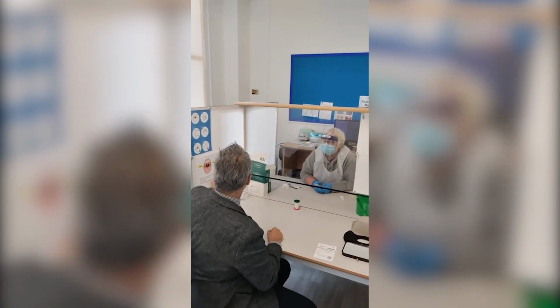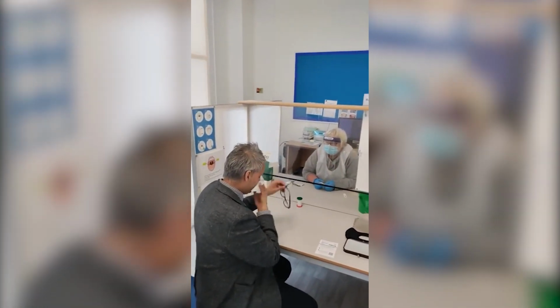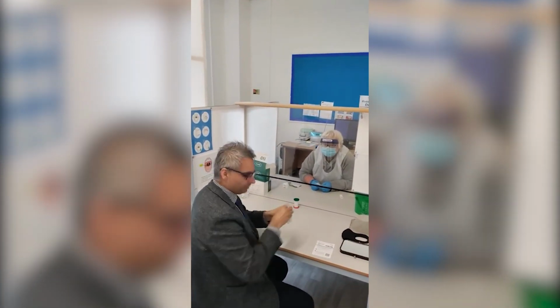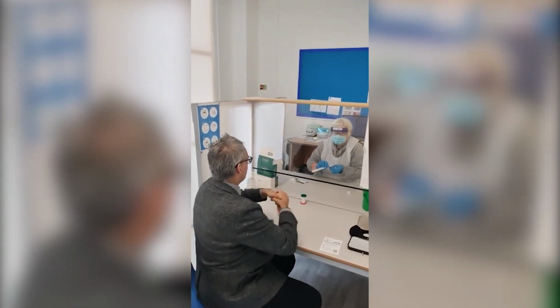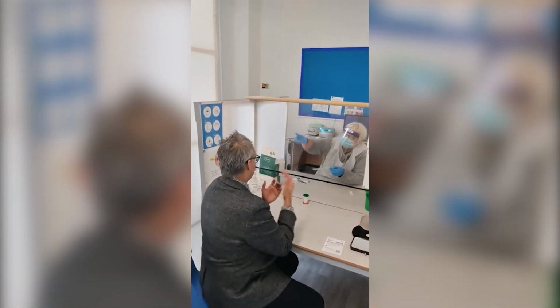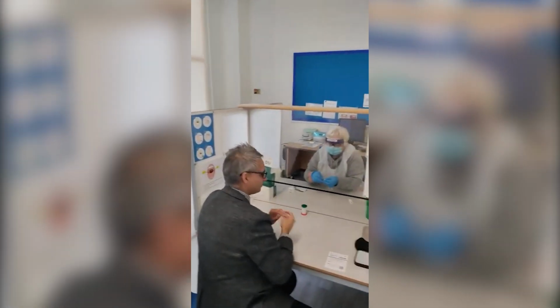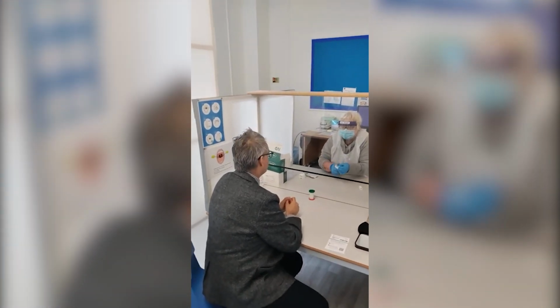So before you start, could you blow your nose, please? Of course I can. Here we go. Okay. And then could you sanitise your hands as well? Of course, using some alcohol gel there. And you have a mirror there to help you find your tonsil, and you've got diagrams there if you're a bit unsure where you're going. Fabulous. Great. Okay, and then I'll have this back off you when you finish, so don't put it on the desk or anything.